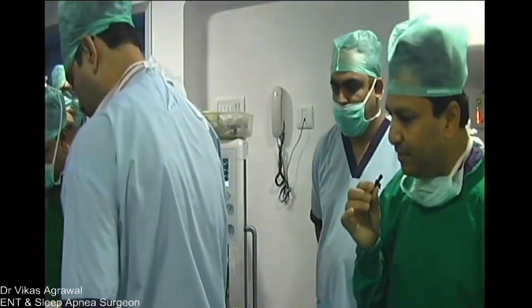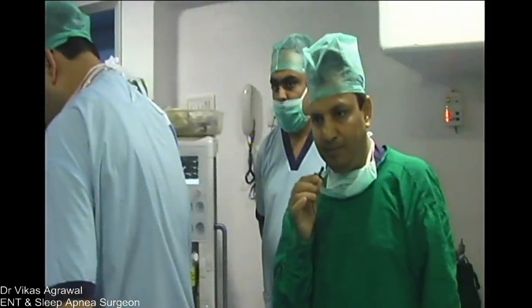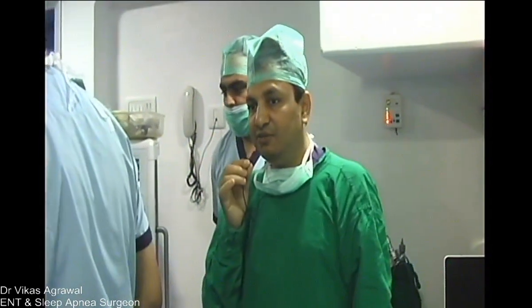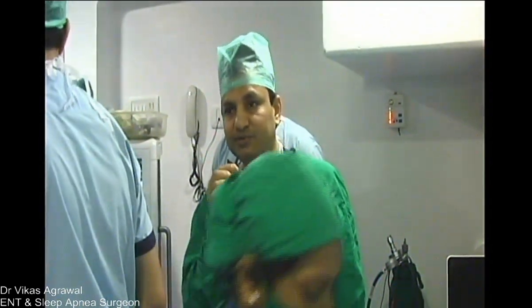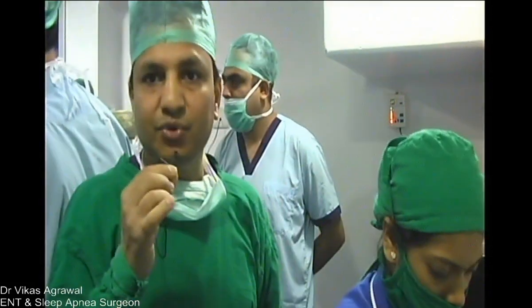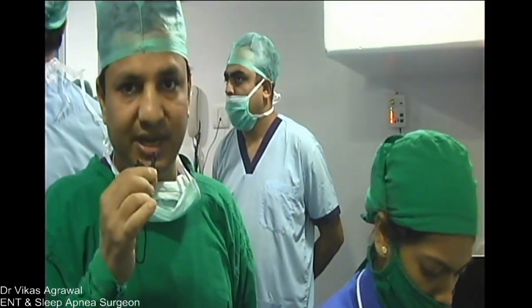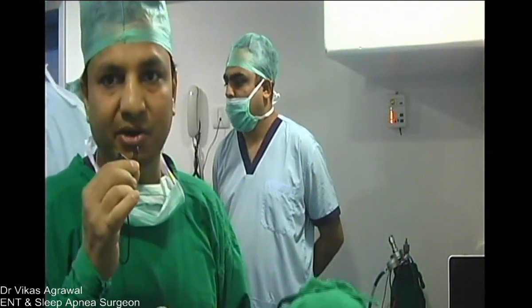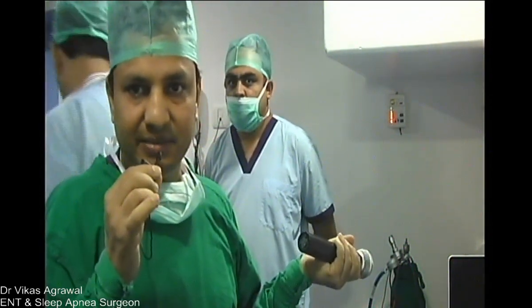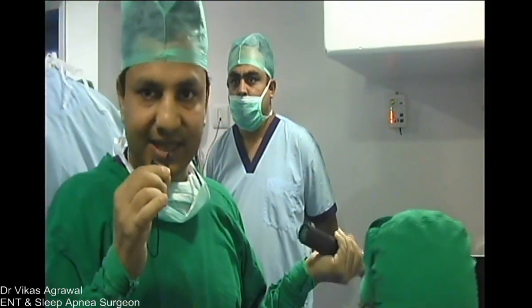If the patient also has a deviated septum and a big turbinate, we have to decide which side we put the nasal tube in. When we are doing base tongue surgery, we have to put a nasal tube, because if you put an oral tube, the tube will keep coming in our way. So we have to decide which side. He doesn't have a grossly deviated septum, so we can put the tube on either side.